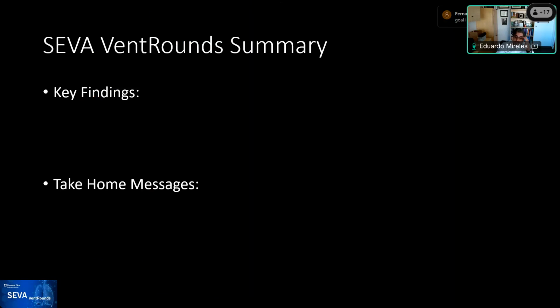So what are the key findings for today? This is a Satoshi moment. I know I don't see Satoshi online, but he recommended that we do this. So we talked about a couple of key findings here. We talked about the loaded breath, and I think that that's an important concept. That's a type of severe under assistance.